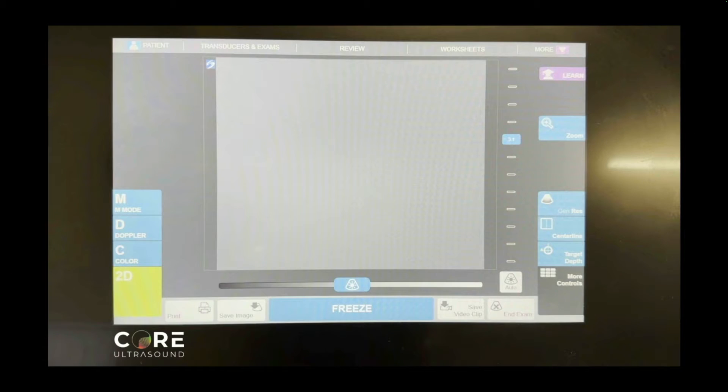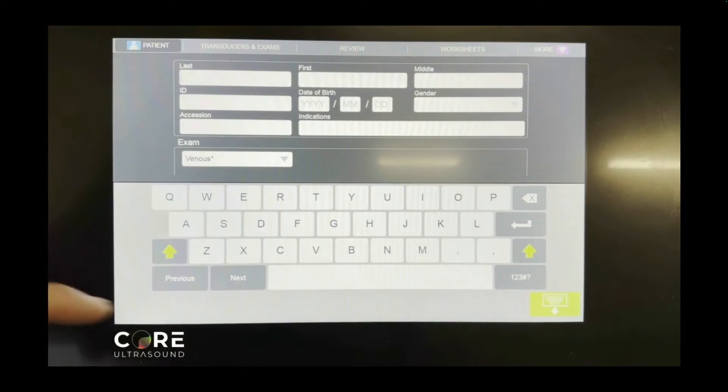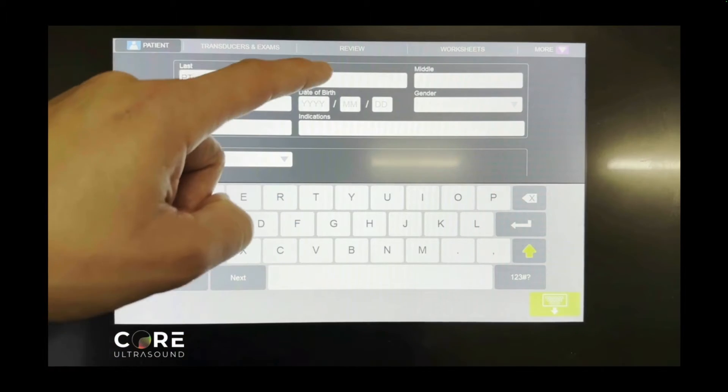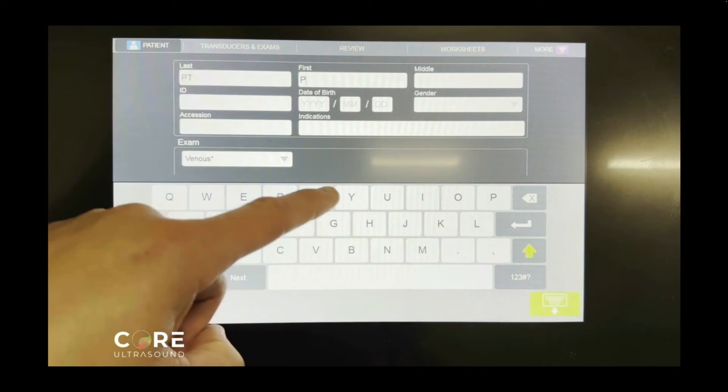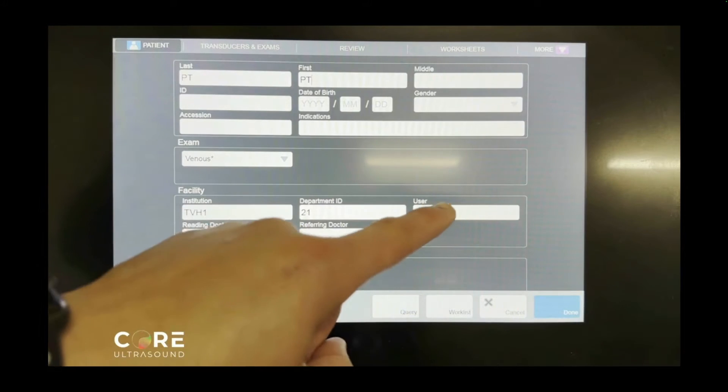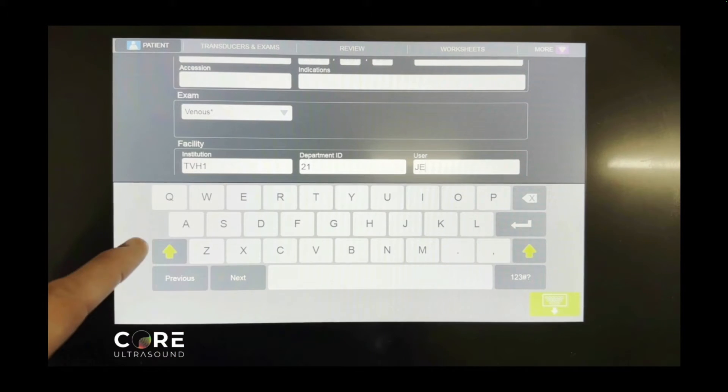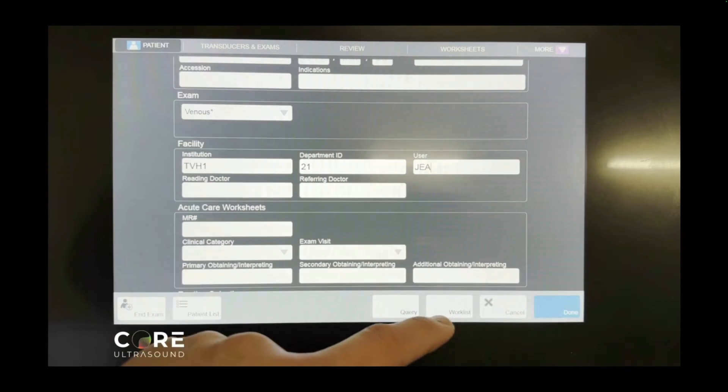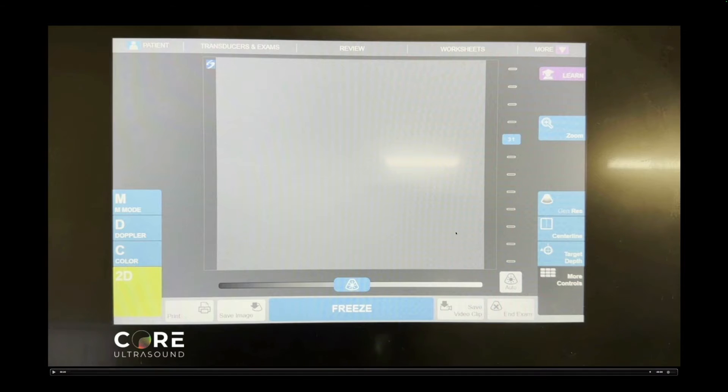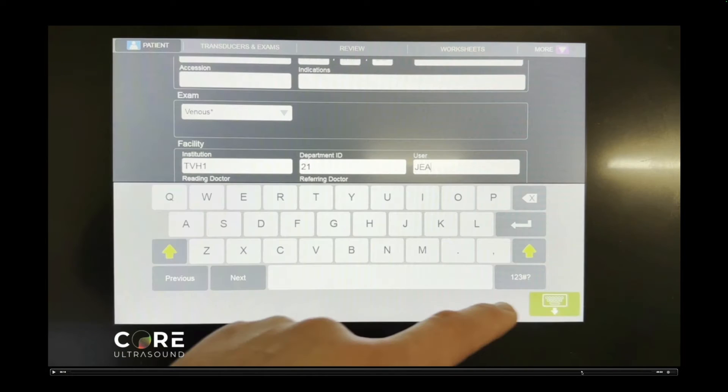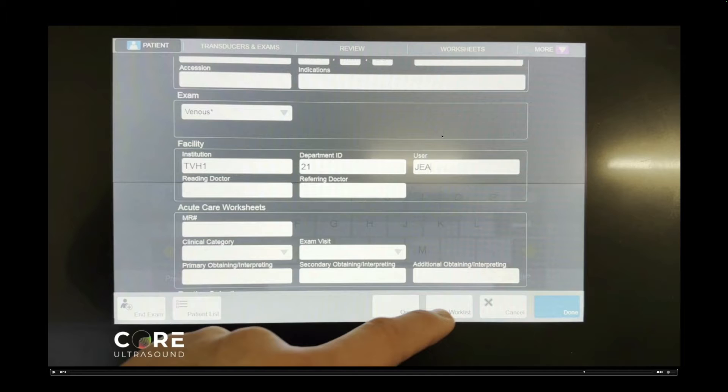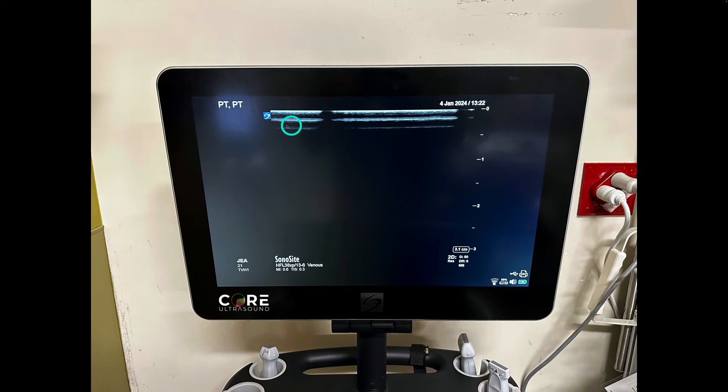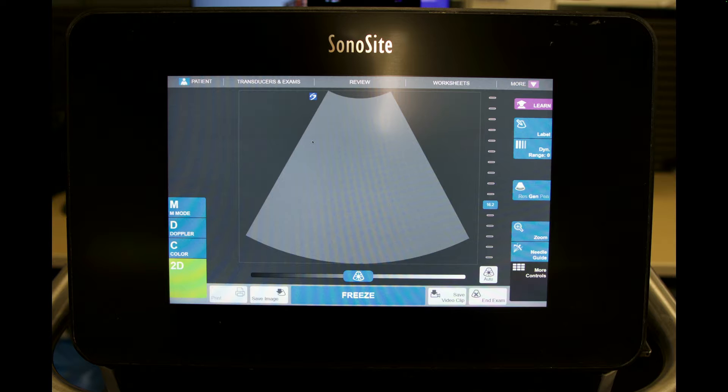Let's talk about how to put in patient information. So what you do is you're going to hit that patient button and you can manually put in whatever the patient's name is there. And depending on if you have any kind of EMR integration, you might actually have an orders based pathway or an encounter based pathway, and then you can pull up the patient's information straight from there. But just in case you don't, this is how you put it manually in. Username goes here. And honestly, that's kind of important because that's how you can identify which scans are yours and which scans aren't. We can see that after I put in that information, the patient's name is here and my initials are down here.